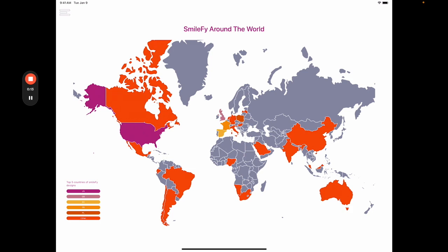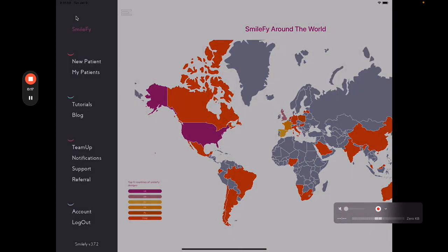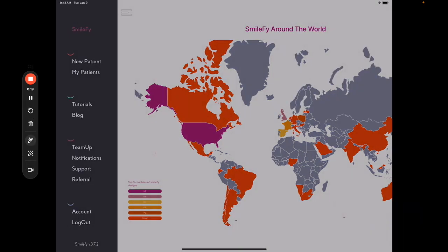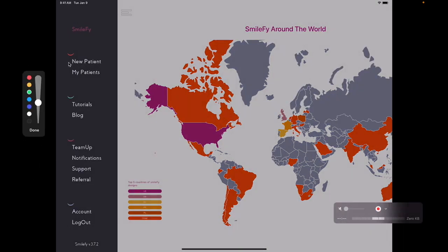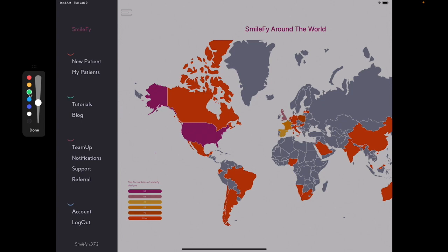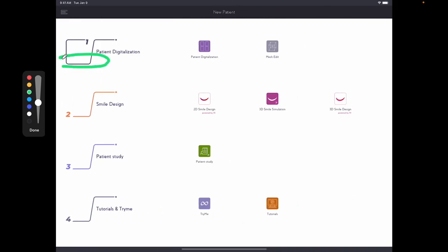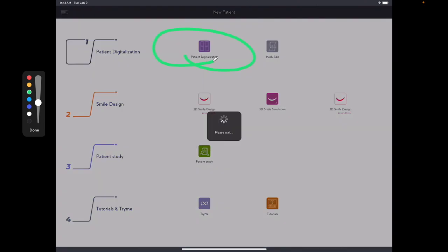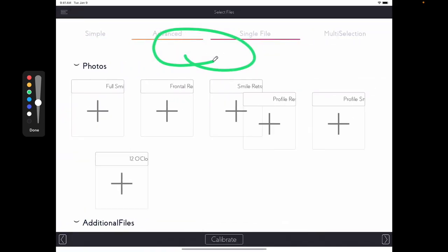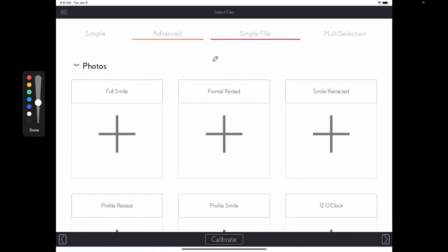First thing we do here, we go to the menu, which is on the top left corner, then you go to new patient and select the patient digitalization. So that's how we will start any case.